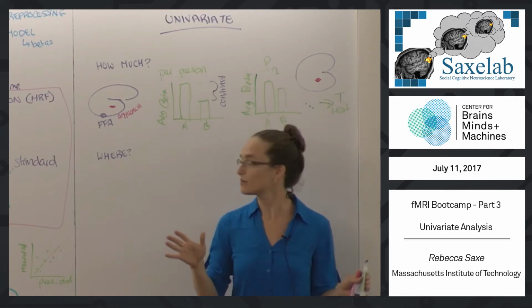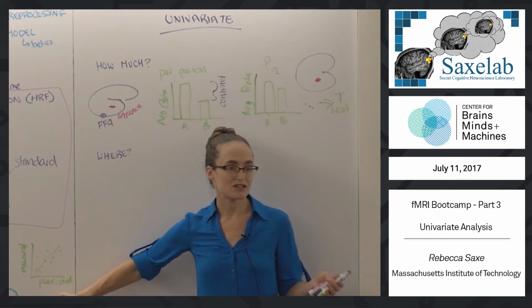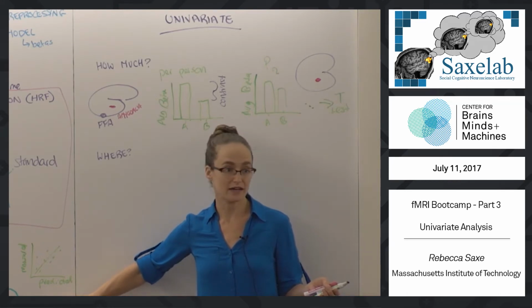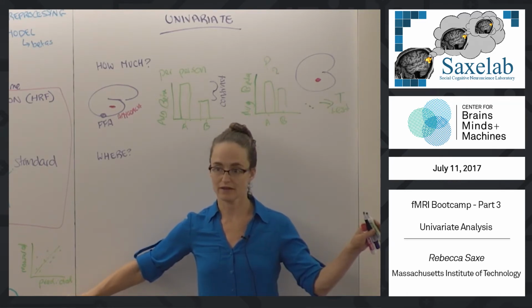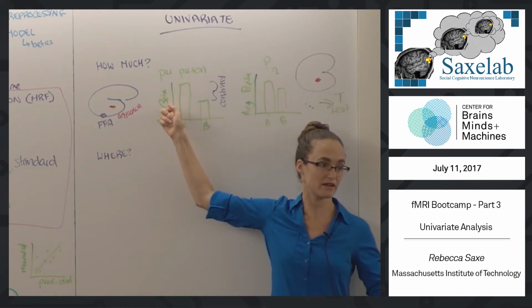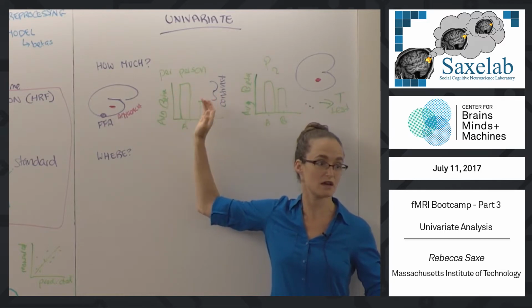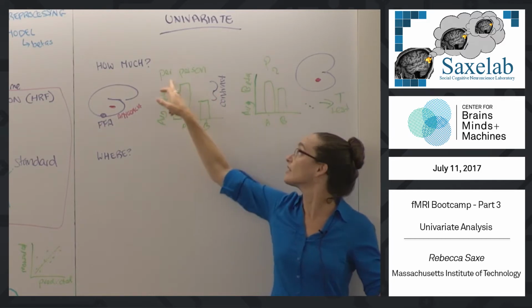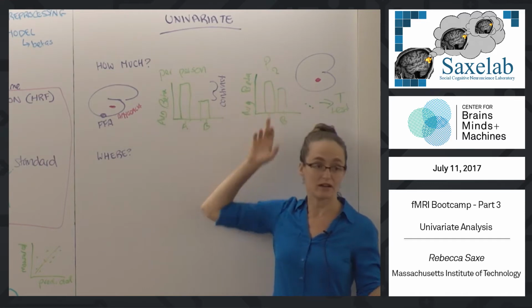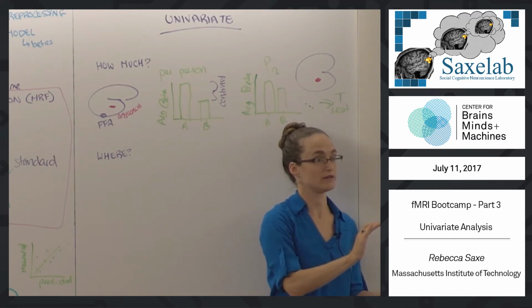So one thing to note about that analysis is that the variability in terms of how well the model fit the data is gone, right? In this analysis, we don't know how well the betas fit the original data. There's no noise per person in this analysis. All we know is, in the end, the beta was higher for A than B consistently across people, right?